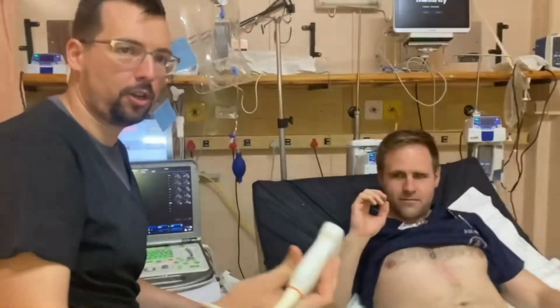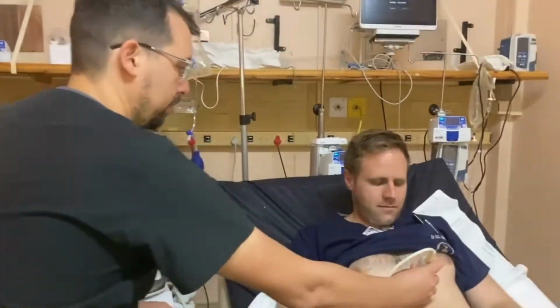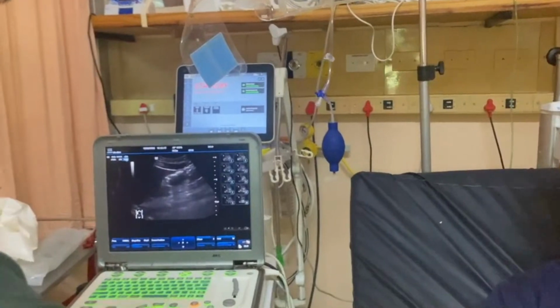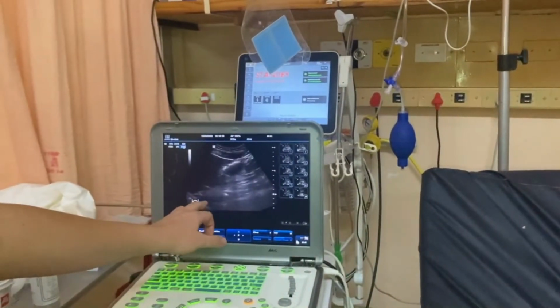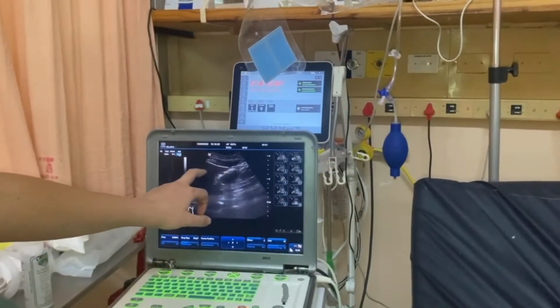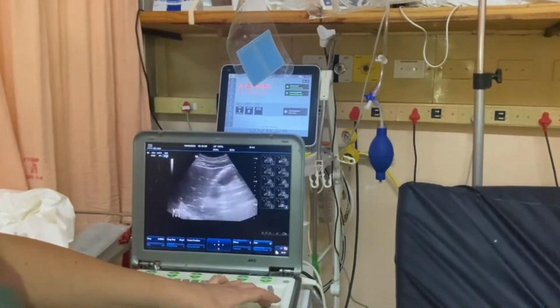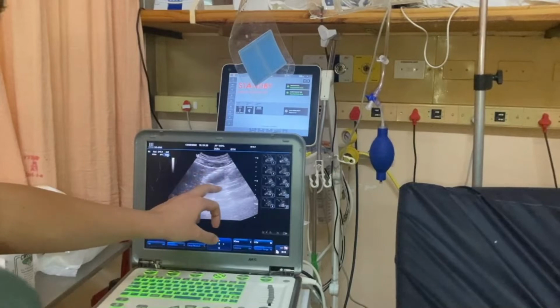So again, we start off supine, and if that is positive for fluid, you would not proceed with an elective sequence. Hold it there. Alright. Okay, same thing, midline, you try and find the aorta, which is going there, and you see liver, and below that is this complex structure, which you can now see is much fuller.